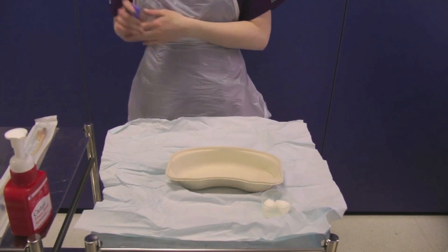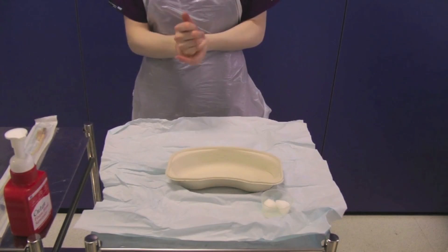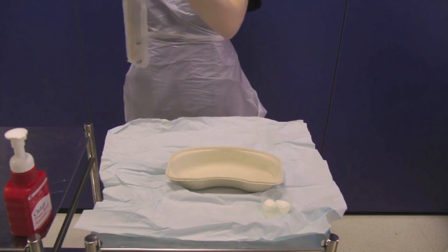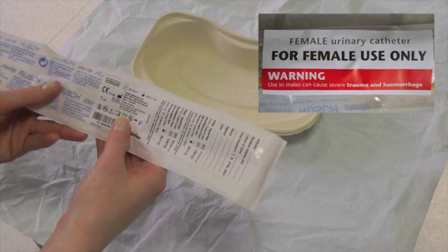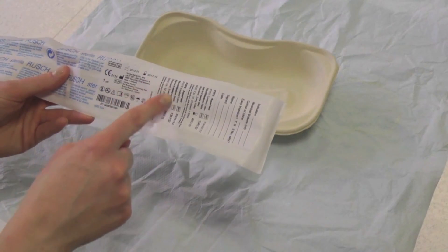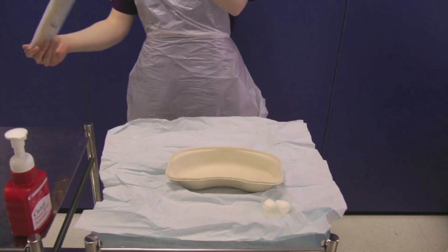Remove your gloves and decontaminate your hands. Take the selected catheter, ensuring you have the correct size. A female catheter should never be used in a male patient. Check the expiry date and note the stickers on the catheter pack that must be saved for use in the notes later.